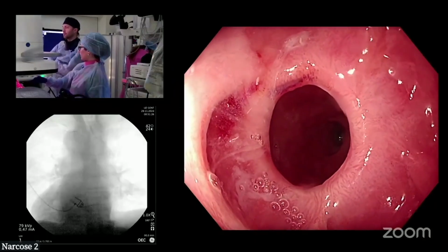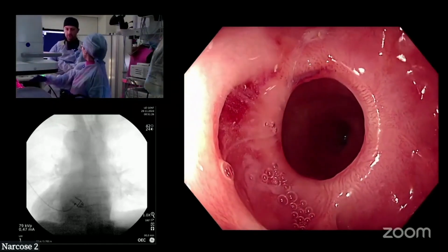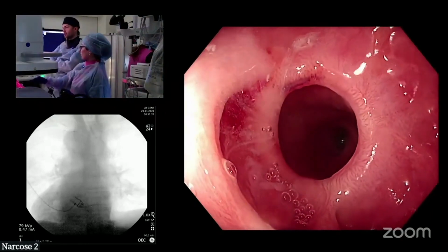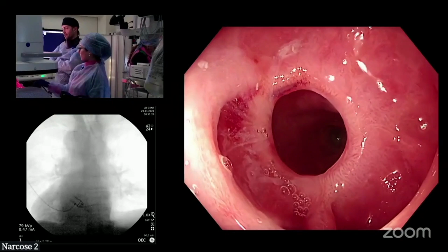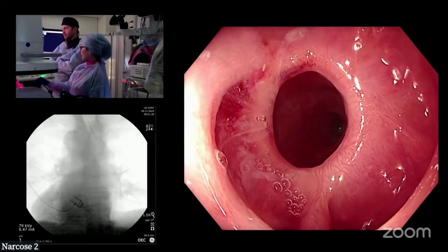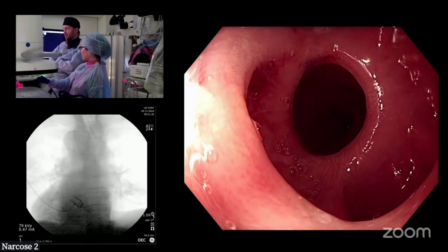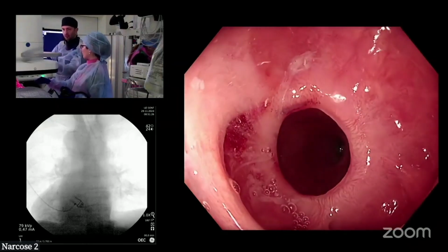Something about a previous report? Yeah, what they dilated it to before. Like what sort of distance it got dilated to before. I think if you're not sure about a stenosis, about pushing the scope through, you have two options. One is to ask someone else to feel and see what they think. Another option is just to take a dilation balloon. But I think in that order, ask someone else, but if it's not someone, take a dilating balloon, right?